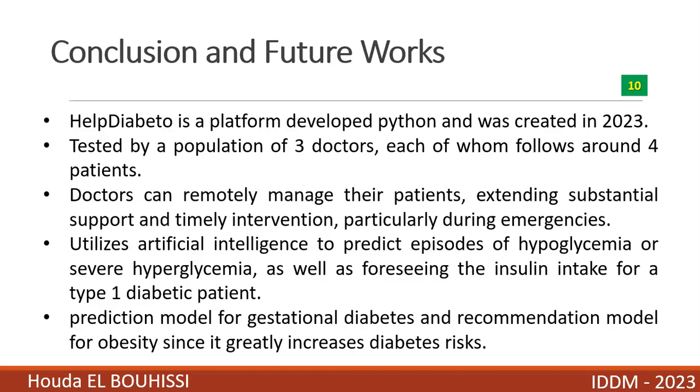Also, the patients have limited education and cannot manage their disease individually. For patients, using the application is not a big deal since all the time they receive notifications. They only record their glucose level, which is sometimes registered by a glucometer. The deployment of the applications generates datasets comprising information from diabetes patients, which will be useful for various applications.